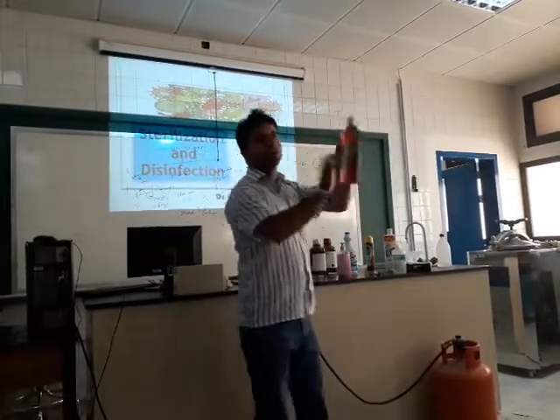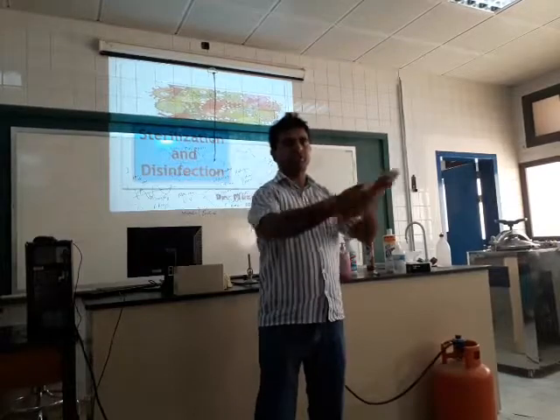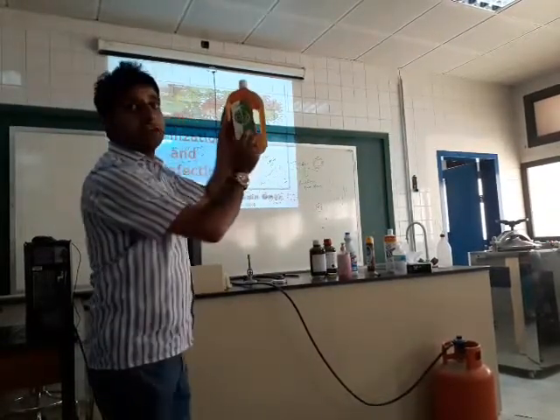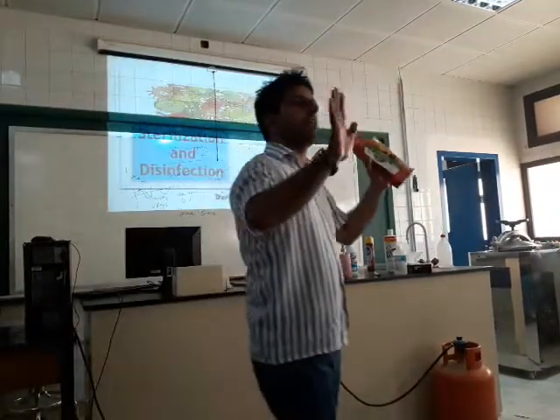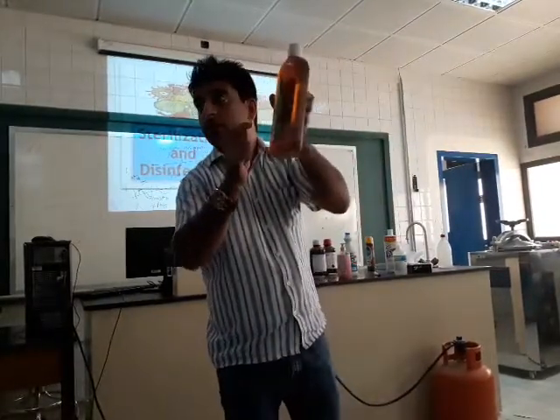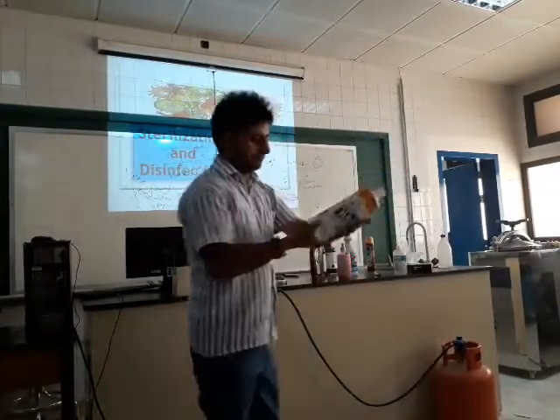And this we use for the floor. And you see, they have written this is an antiseptic disinfectant. What does disinfectant mean? It is a capability to kill all bacteria except spore. It is written here. We cannot use it for hands. We can use it for the floor. You know this very well.